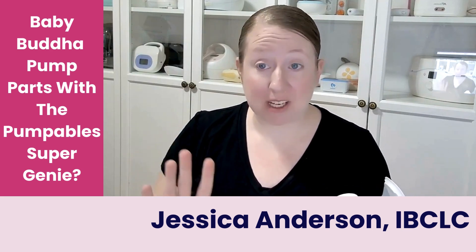So let's actually look at what's happening here. Let's talk about the difference between the Baby Buddha and the Pumpable Super Genie in terms of suction styles — these are essentially polar opposites.